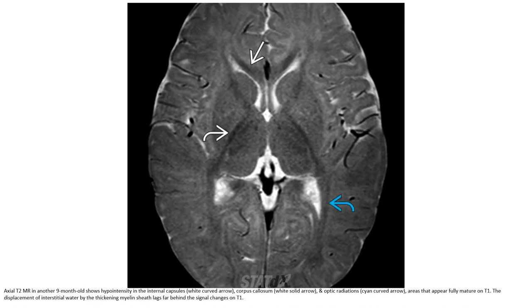T2 image shows another example with hypointensity in the internal capsule, corpus callosum, and optic radiation — areas that appear fully mature on T1. The displacement of interstitial water by the thickening myelin sheath lags far behind the signal changes on T1.